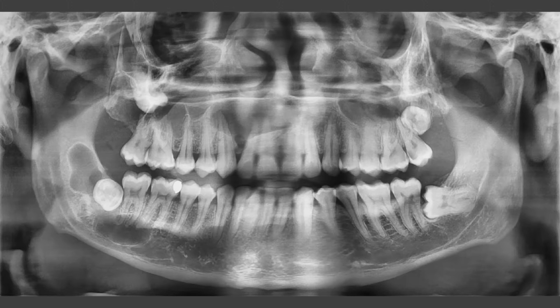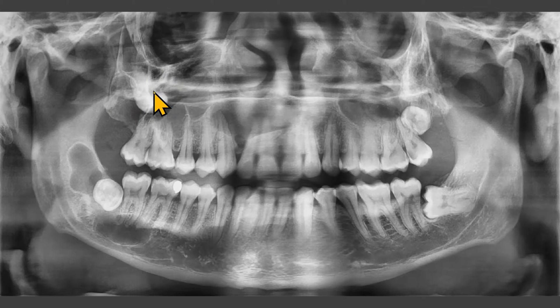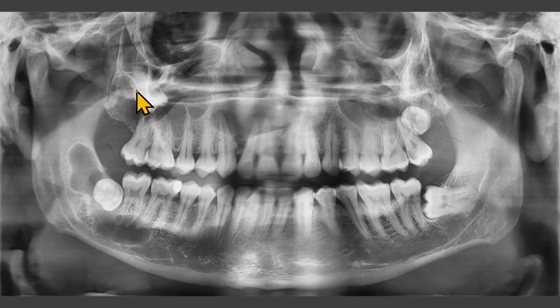On this panoramic radiograph, we see multiple cystic lesions. When histopathological examinations were done later, all these lesions were proven to be odontogenic keratocysts. Let's start with the maxillary right posterior region. This third molar is superiorly displaced. There is a radiolucency in the area of this third molar. We'll be using a CBCT scan to evaluate this area better.